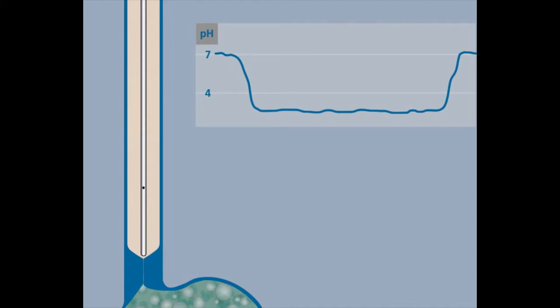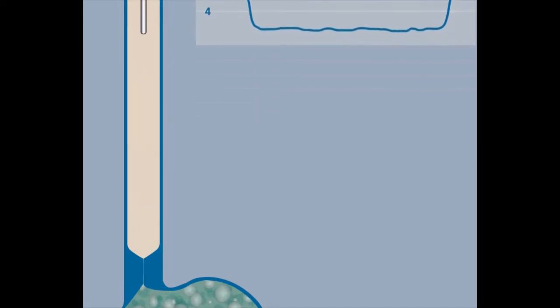This was until recently. Now we have a new technique which combines pH and impedance measurements. This new technique will be explained.